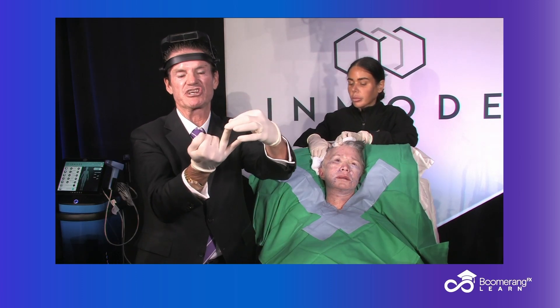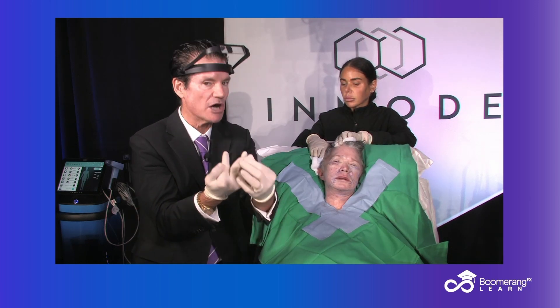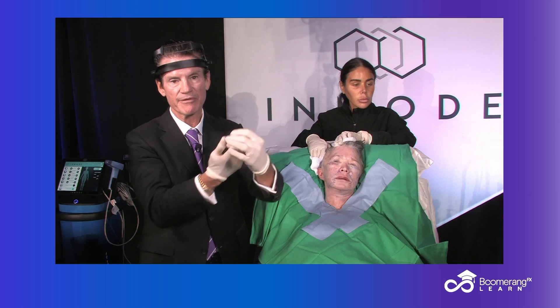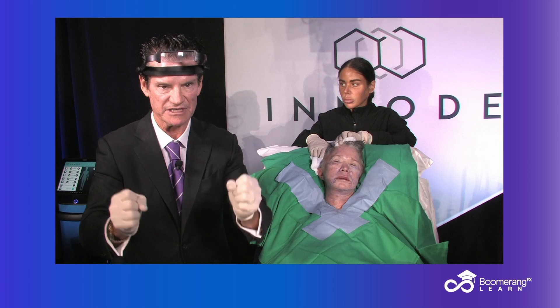Number two, we did injection soft tissue filler. Number three, neuromodulator — uncoupled depressors from elevators. Now number four, section four, the last section: suture suspension, craniofacial fixation.